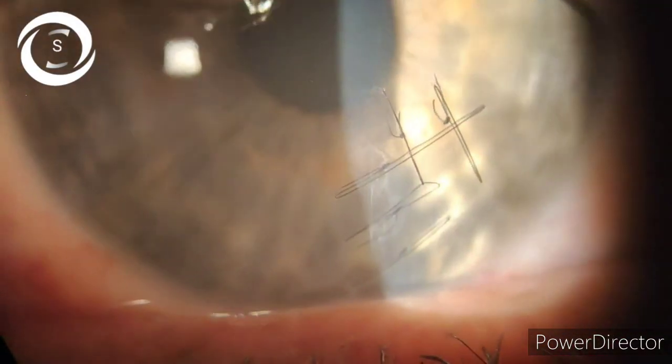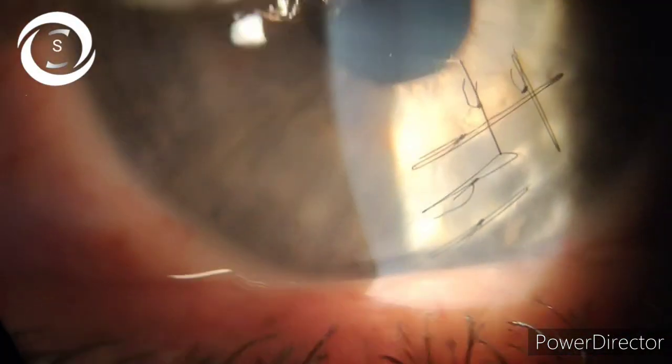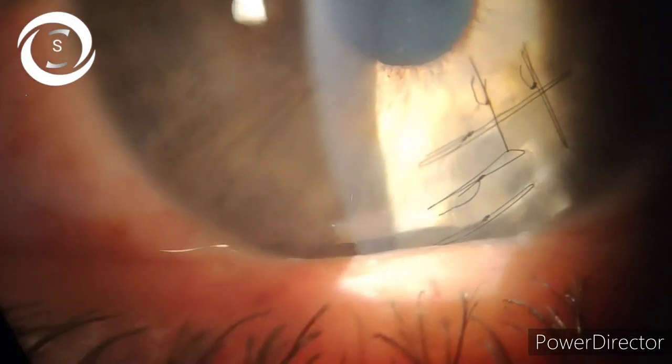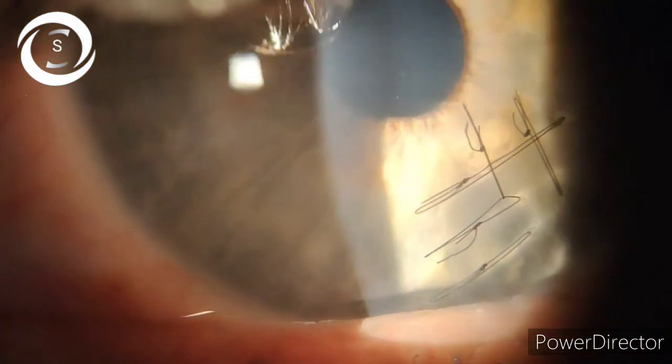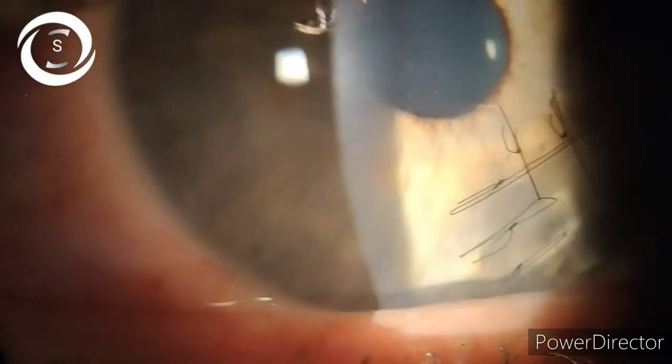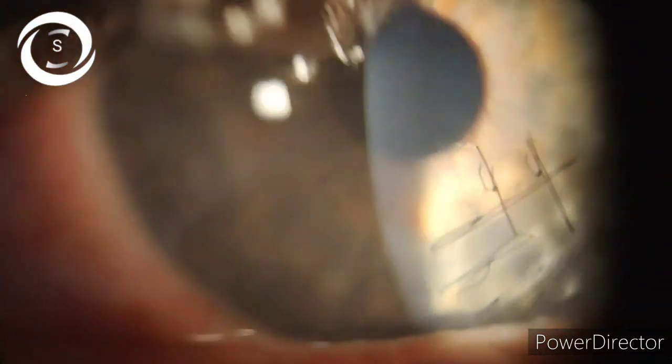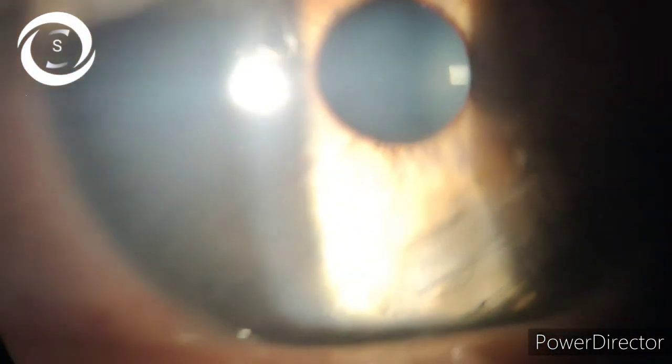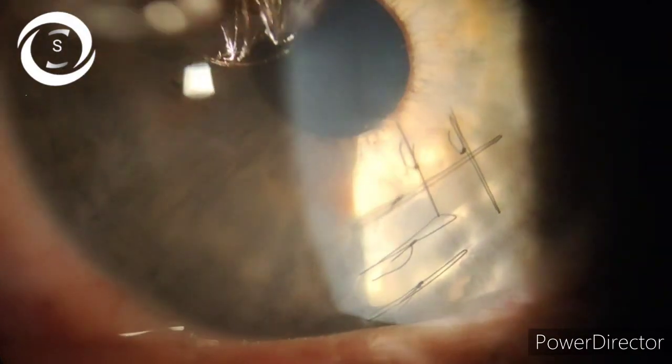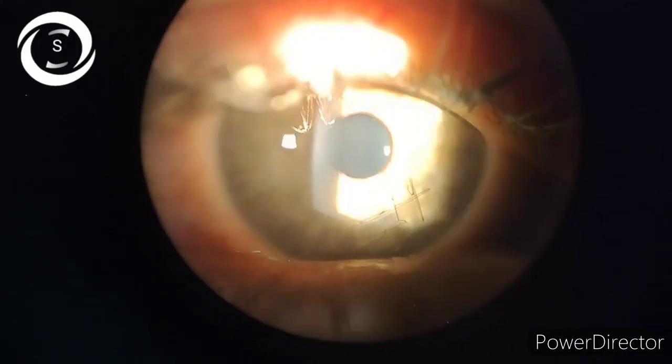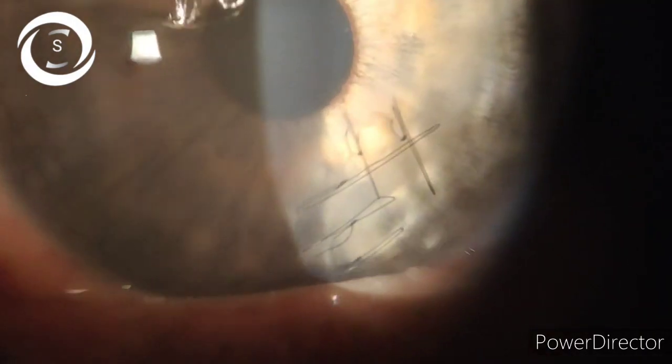You can see how post-op two weeks the corneal sutures look like. Sutures are not very tight, not very loose, equidistant. Anterior chamber is well formed, pupil is round, regular, reactive.